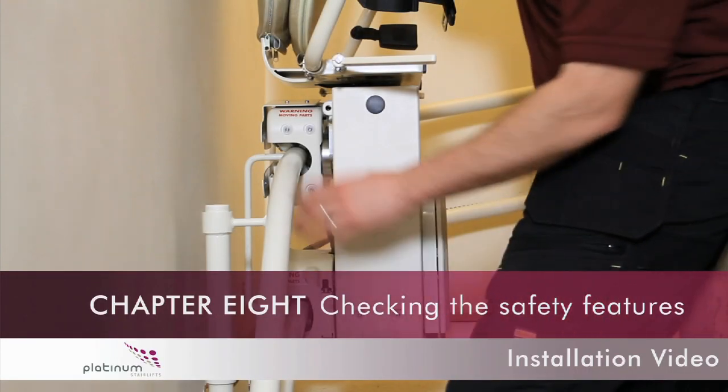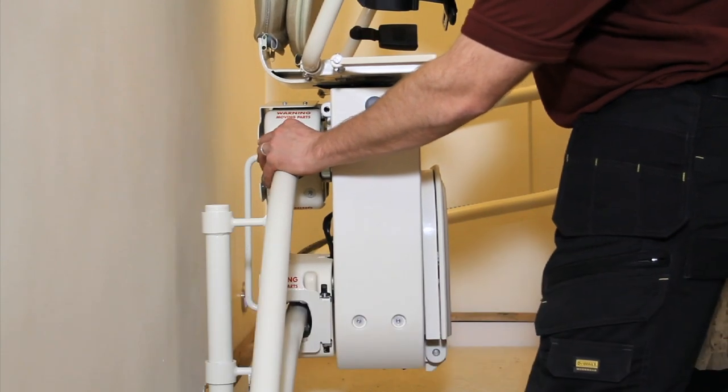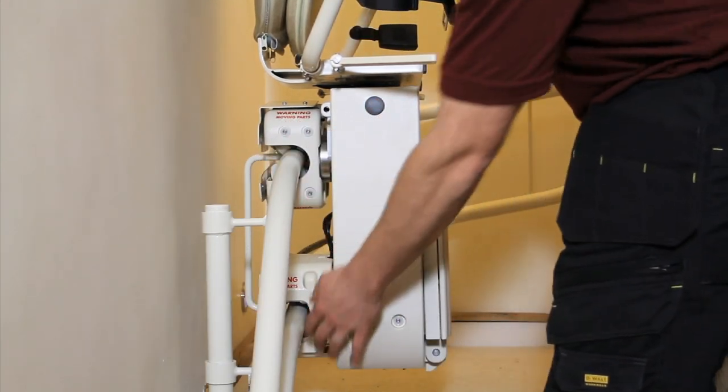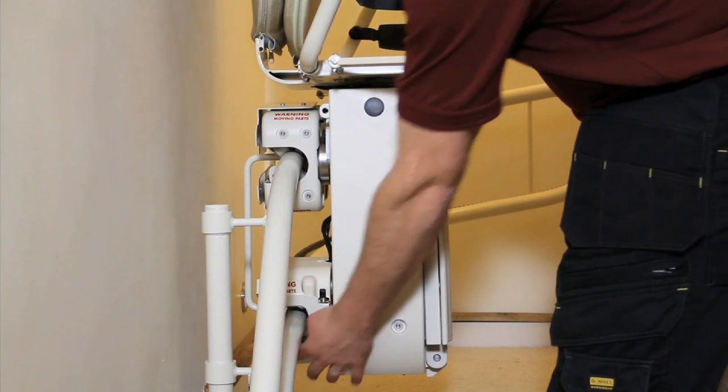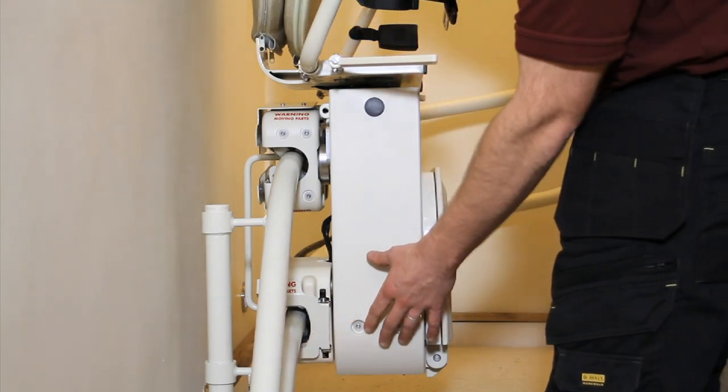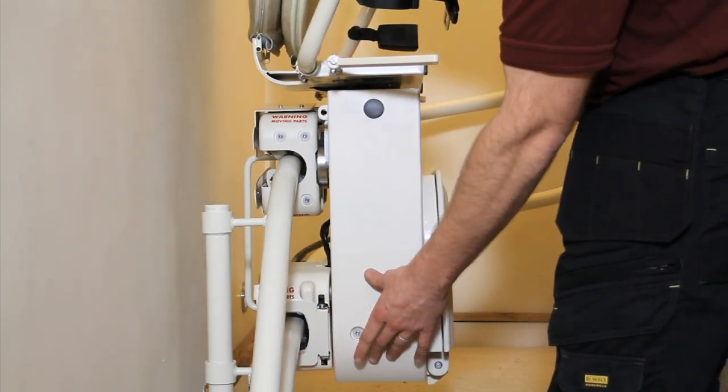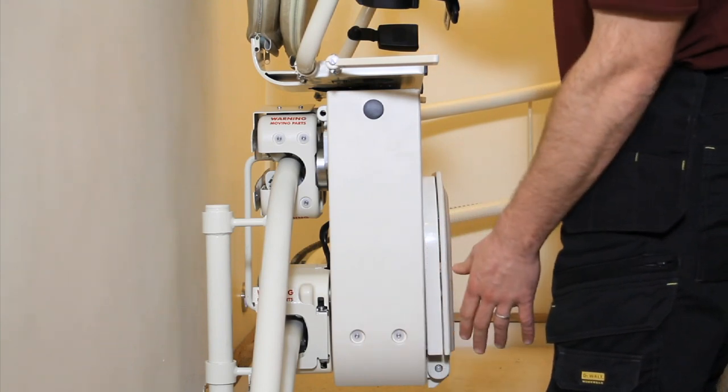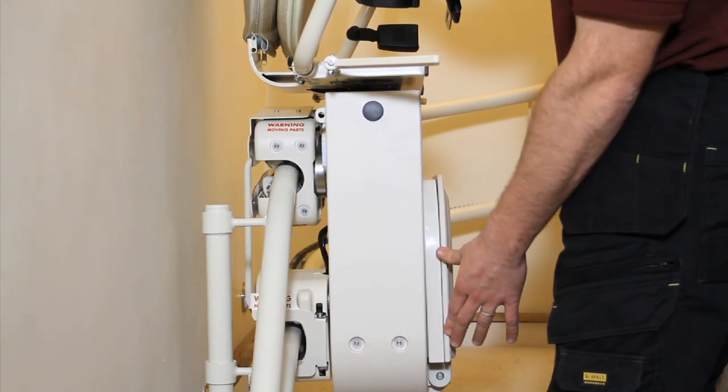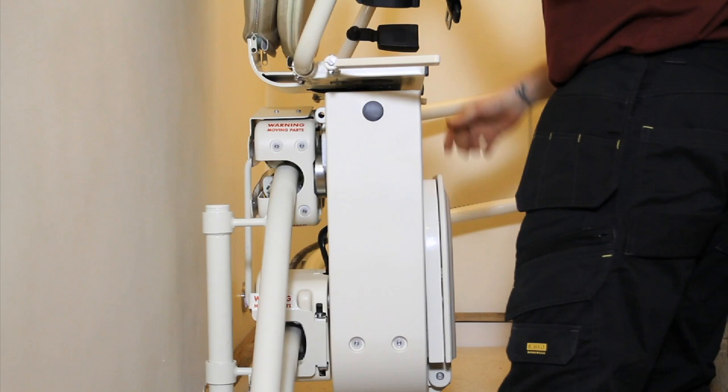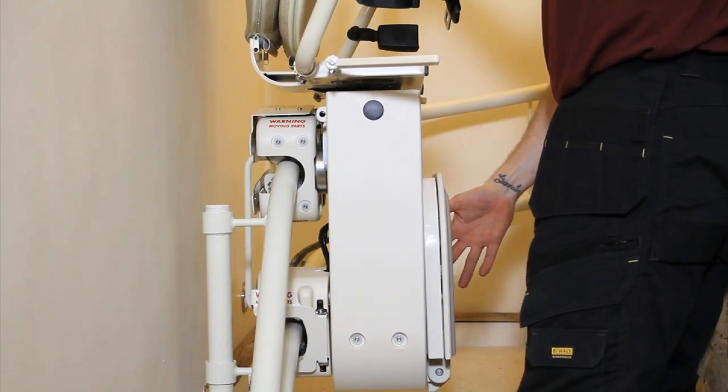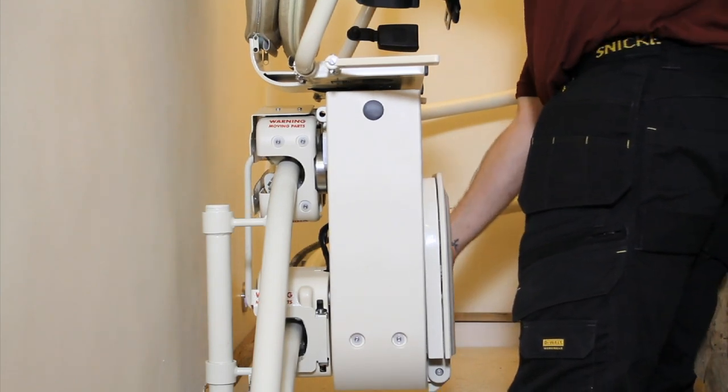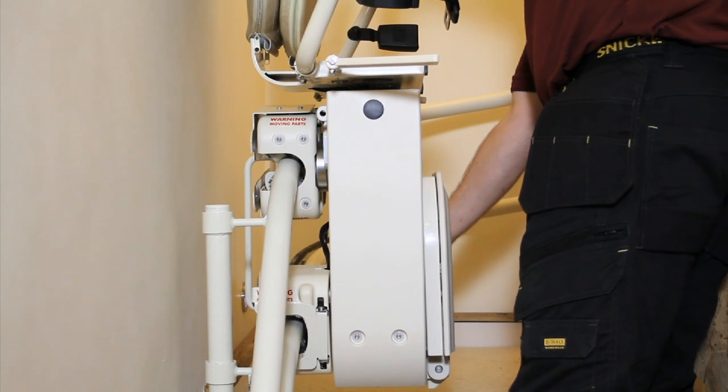Chapter 8: Checking the safety features. Move the carriage to a suitable position on the staircase in order to fully test all of the safety features. Firstly, check that all downside safety edges are working correctly. These consist of the top and bottom skates, side cover and footrest. Now, repeat these safety checks once again, checking that all of the equivalent upside safety edges are also working correctly.